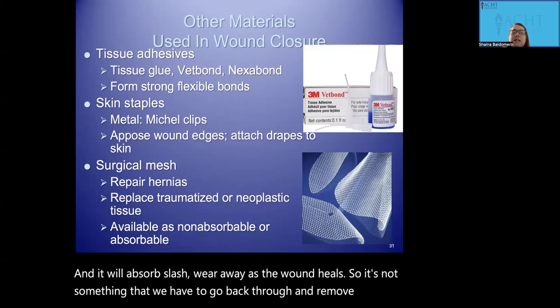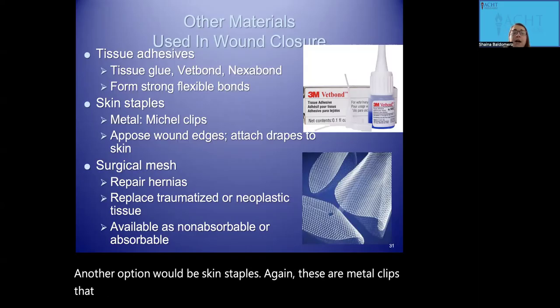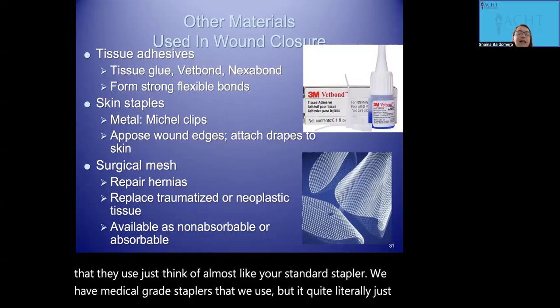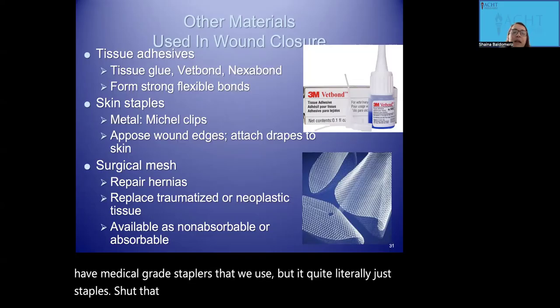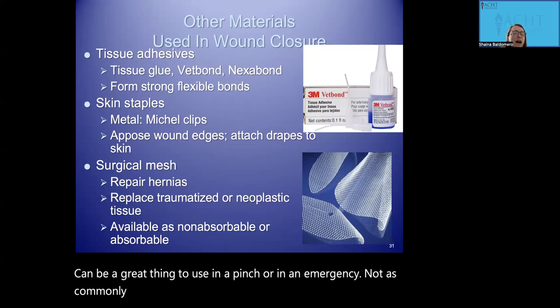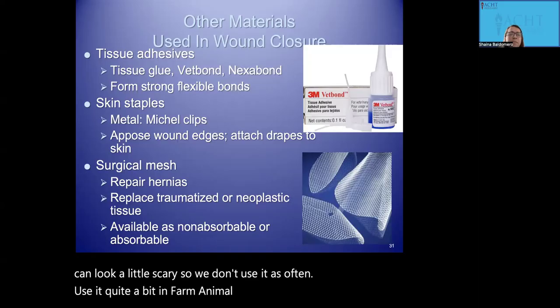Now, another option would be skin staples. Again, these are metal clips that they use. Just think of almost like your standard stapler. We have medical grade staplers that we use, but it quite literally just staples shut that incision. It can be a great thing to use in a pinch or in an emergency. Not as commonly used just because it's not as aesthetically pleasing. It can look a little scary, so we don't use it as often. Used it quite a bit in farm animal medicine, though, I will say that.